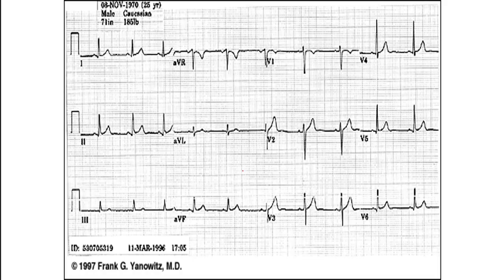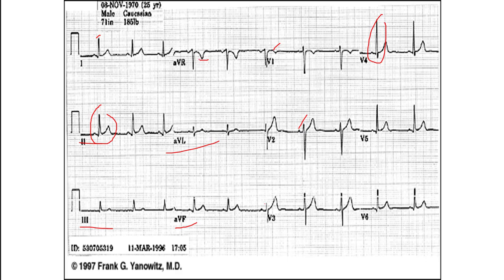Here's an example of what you would see on a 12-lead ECG — lead 1, lead 2, lead 3. Lead 2 may look a little bigger depending on the orientation of the heart. We can see R-wave progression across the unipolar leads, getting bigger as we move across the precordium. We've got AVF, AVL, and AVR — our orphan lead. The T-wave in AVR may look inverted, but remember it's in the same direction as the R-wave because these leads are inverted.